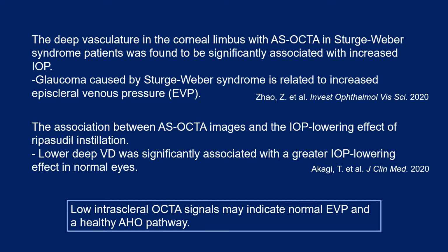Because the IOP-lowering effect induced by ripasudil is thought to require good function of the post-TM HO, this result is consistent with our results observed during the current study. We considered that low intrascleral OCTA signals may indicate normal episcleral venous pressure and a healthy HO pathway.